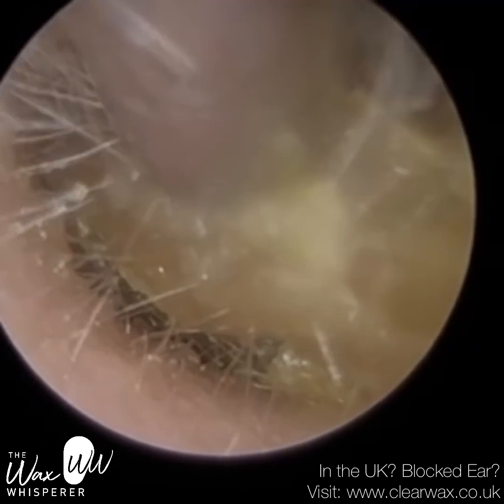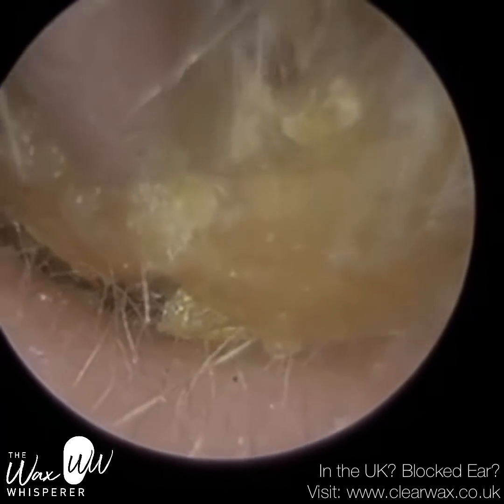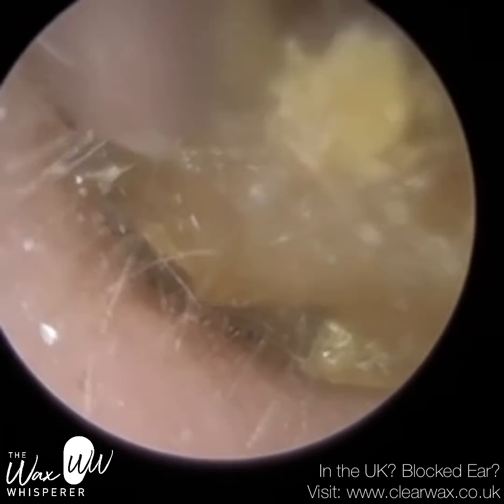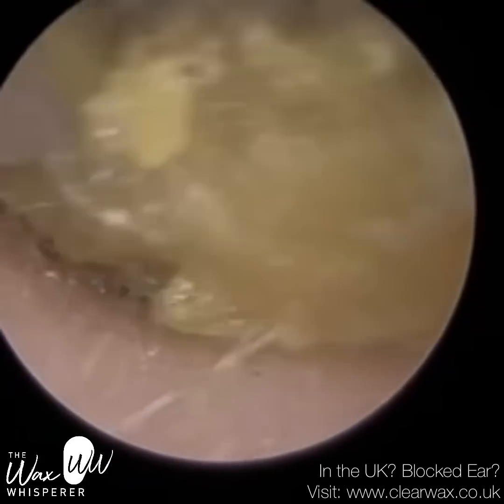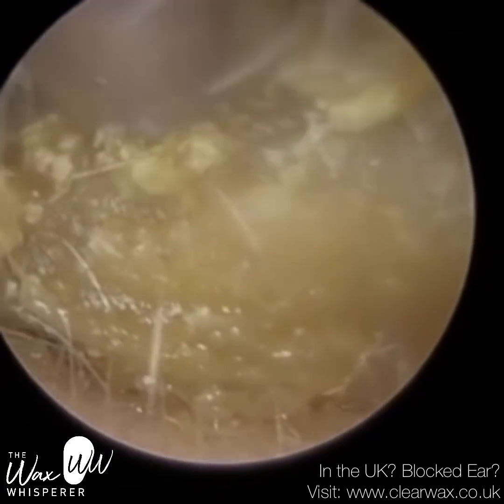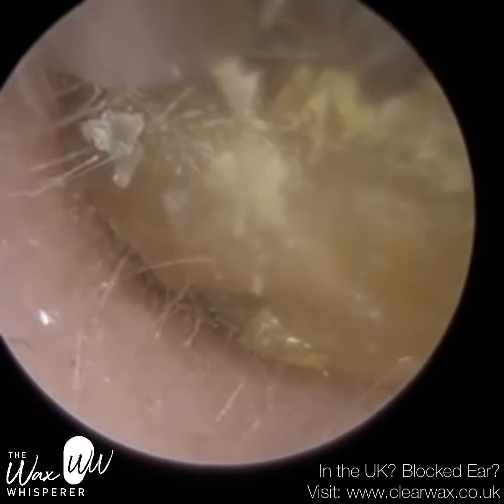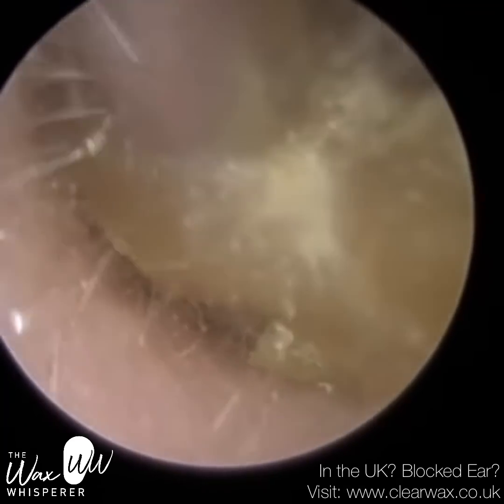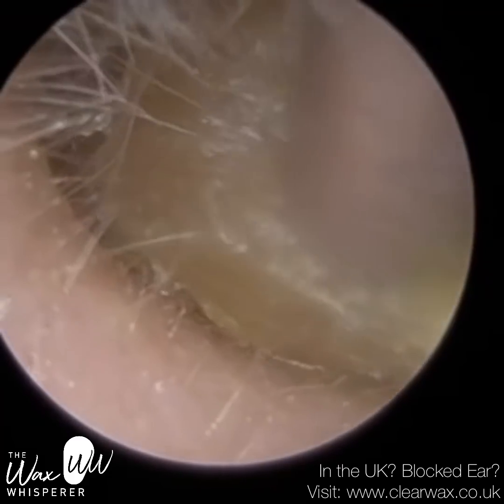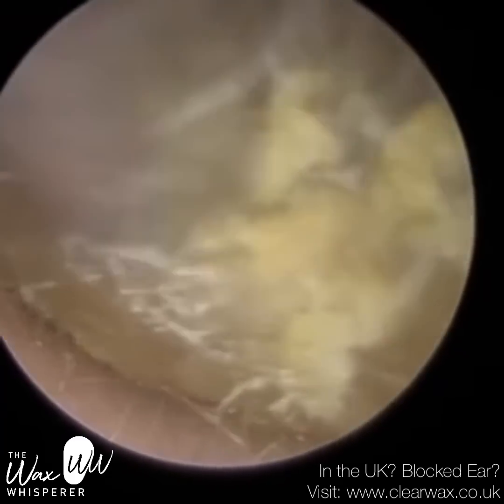This video is upon request. I've had a few people ask if I can compare in a video the view of an endoscope versus the view of a microscope. Prior to endoscopes — they've only really been commercial in terms of earwax removal since Clearwax launched the EyeClearScope — so in the last five or six years.